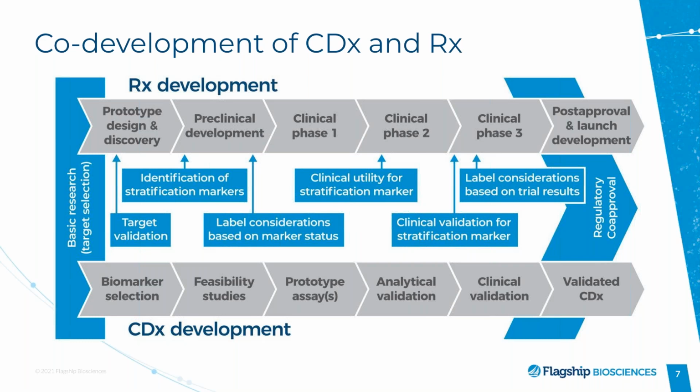The nice thing about tissue-based diagnostics is that almost every single patient has had a biopsy and has tissue available, often in paraffin, to be able to make the diagnosis, so you don't have to maneuver a lot to get an additional kind of sample. And I think it's one of the great advantages of tissue-based diagnostics.